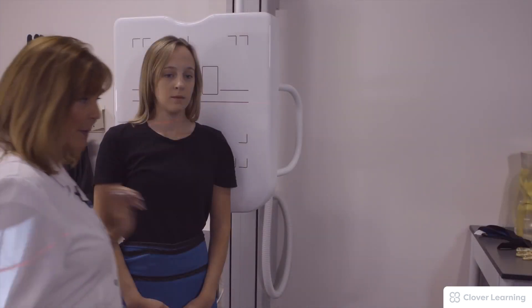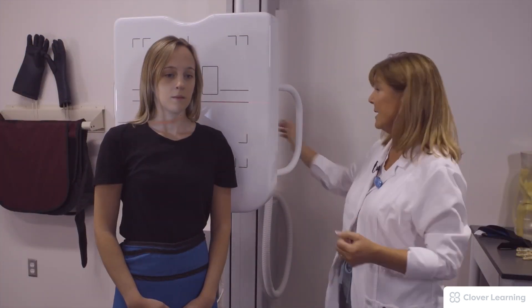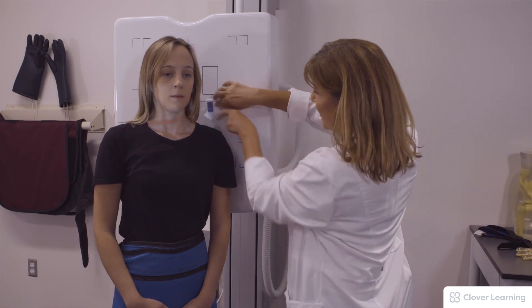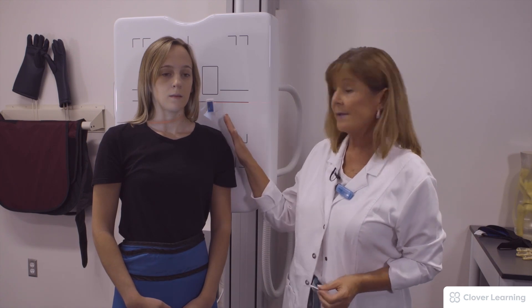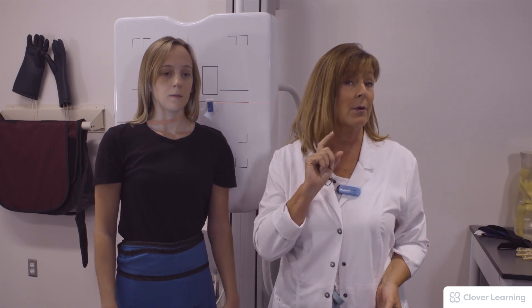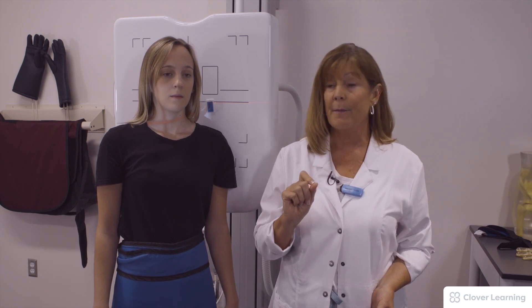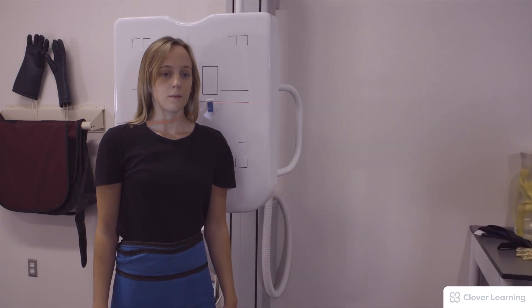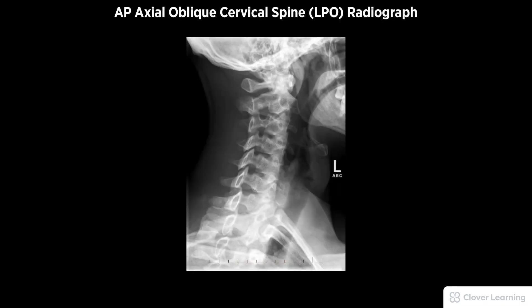The patient is LPO, so I'm using a left marker indicating the left side of the body. I have 15 degrees cephalic angle, centered at C4, at 72 inch SID. This is an LPO, which will actually show the right intervertebral foramina. The patient is shielded, will hold very still, and the exposure is made.